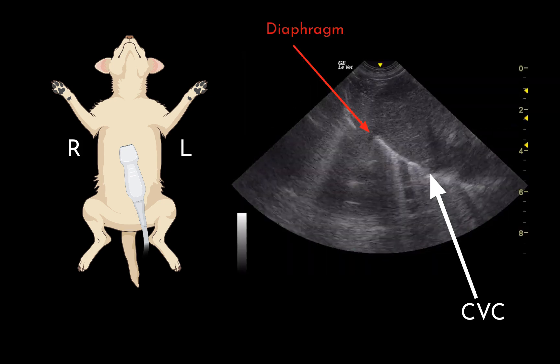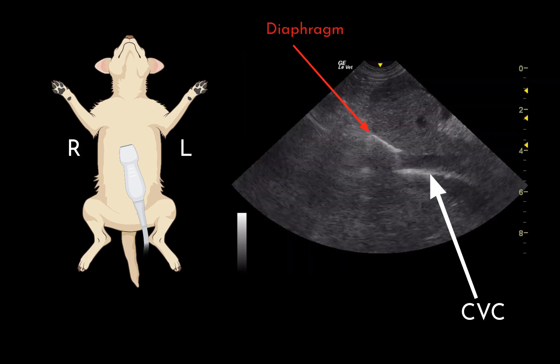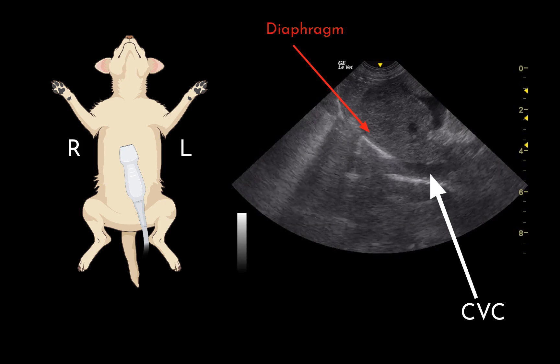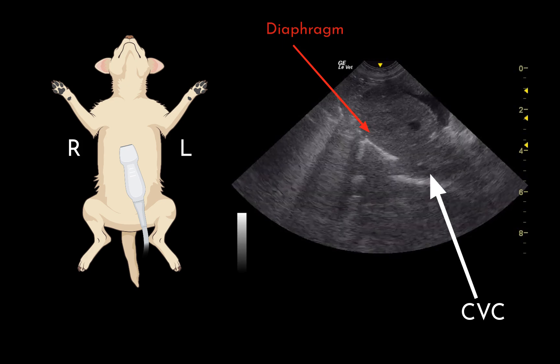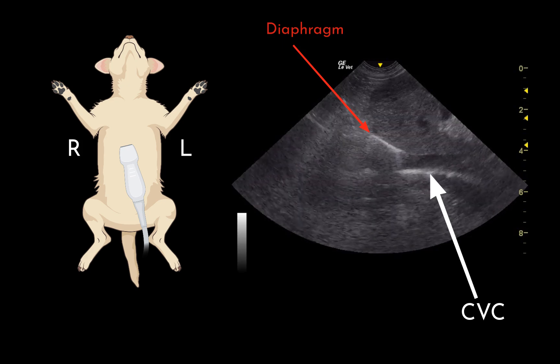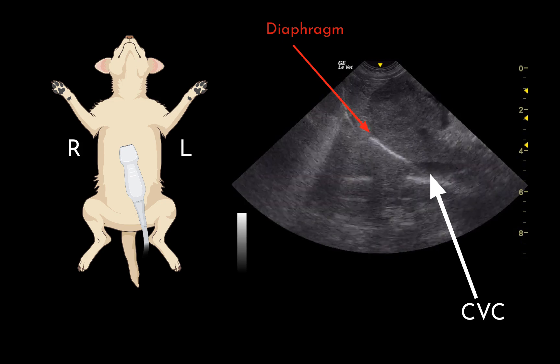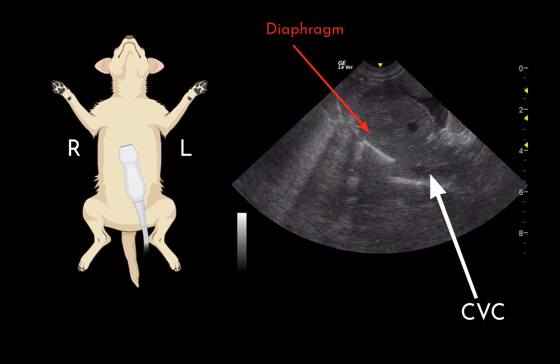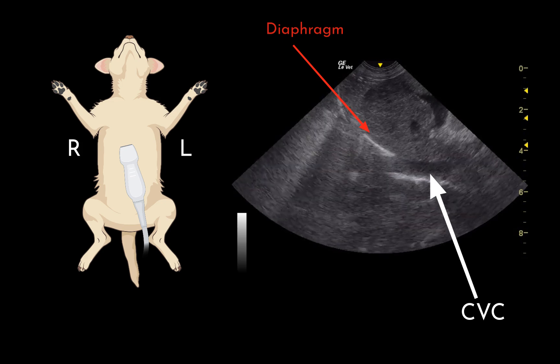Then, the ultrasound probe is slowly fanned off either side of the CVC and returned to the position where the CVC is subjectively felt to be at its widest diameter.